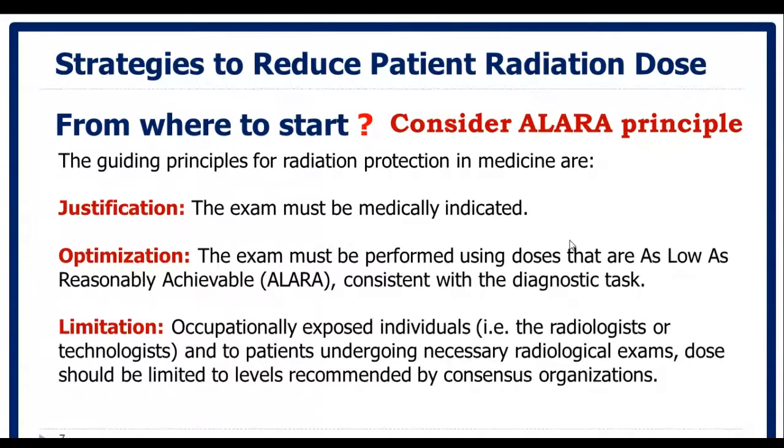And after that, we need to recommend changes if there is any variation: changes to the protocol, changes to the equipment configuration, changes to the diagnosis and reporting. And this will be the basis of reviewing these procedures.